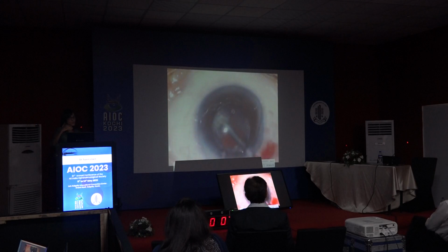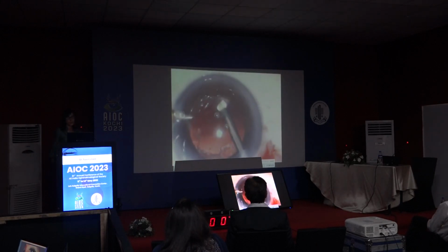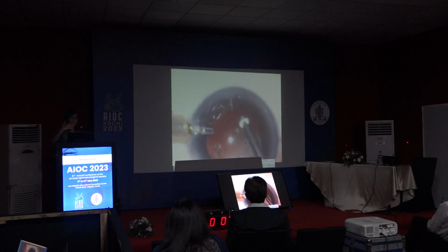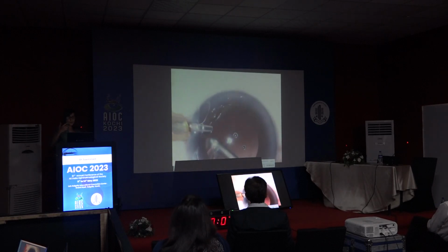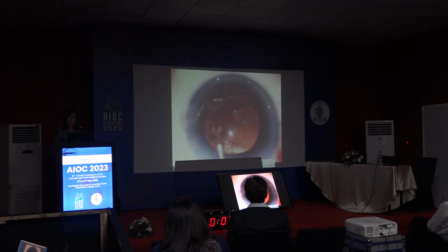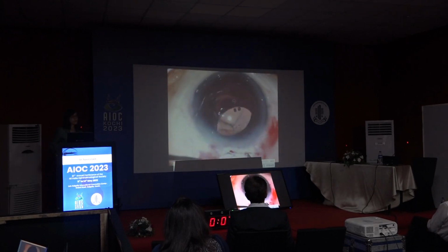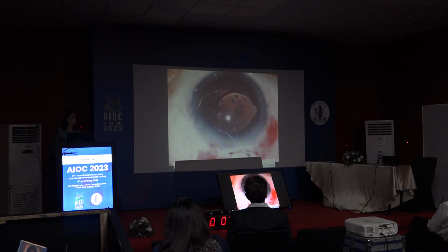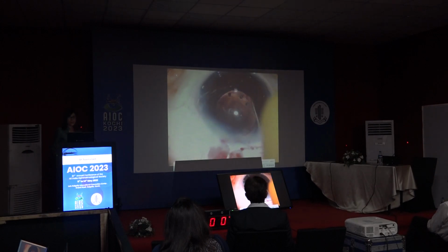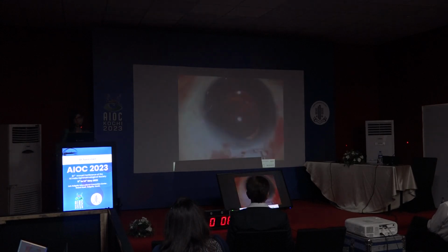Today, if I had fragments falling, I would just let them drop, which I will show you in one of the coming cases. At the end of the limited anterior vitrectomy, the cortex is removed using the aspiration mode alone of the vitrectomy, and finally a lens is placed in the sulcus. We had a big incision anyway, so I put in a rigid 5 mm lens with care and caution in the ciliary sulcus. The patient had a good end result.